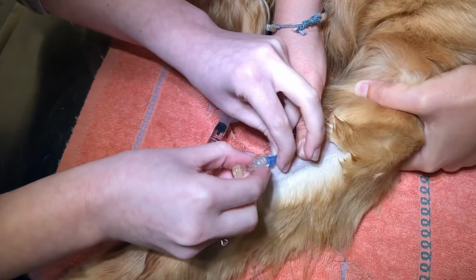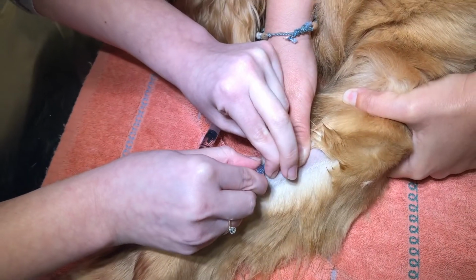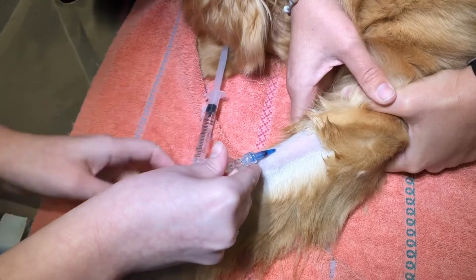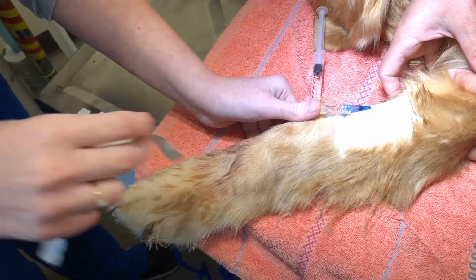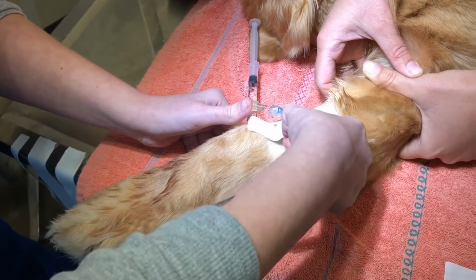And I'll attach my T-set. Okay, and then I'll go in with my first piece of tape, so skinny tape, sticky side up.